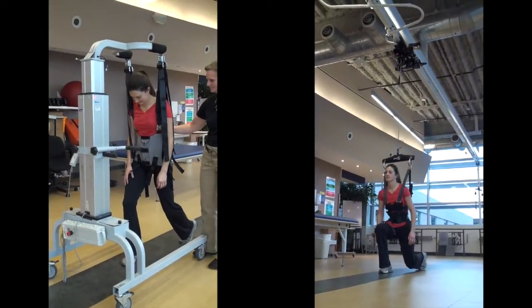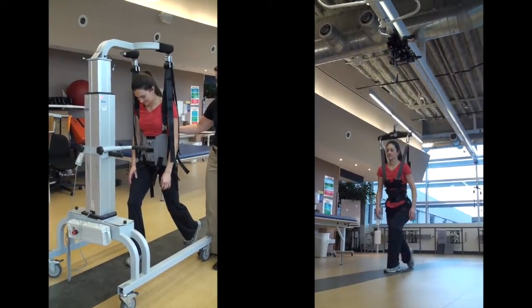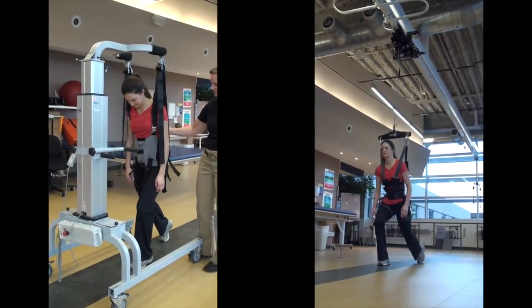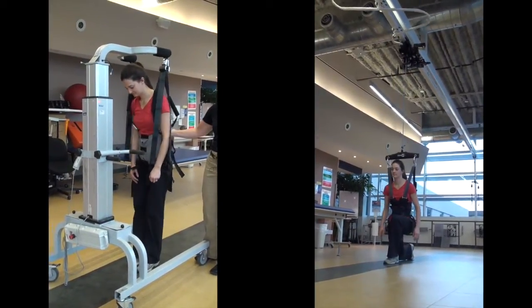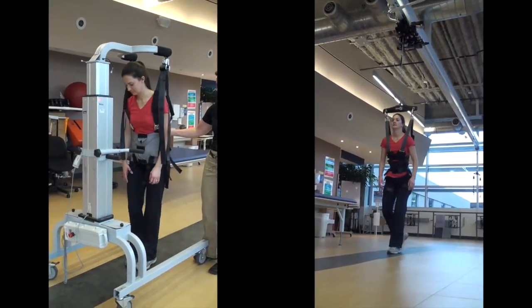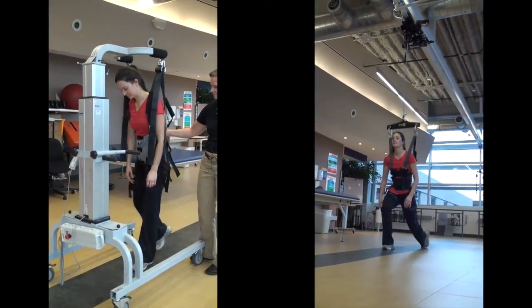The dynamic body weight support of Zero-G safely allows a wide range of dynamic activities, such as getting to the floor on one knee. This activity is impossible in a mobility frame, which restricts downward movement.